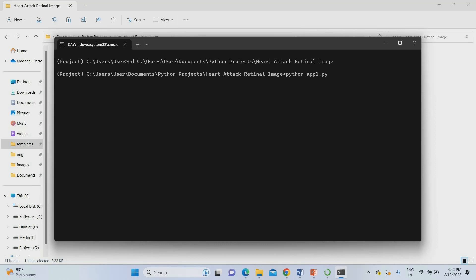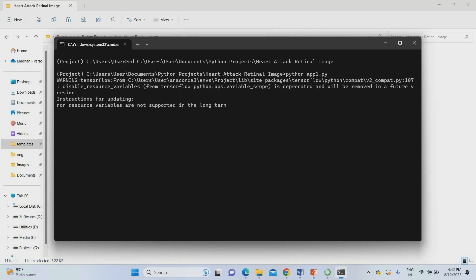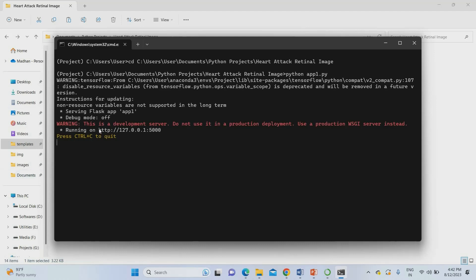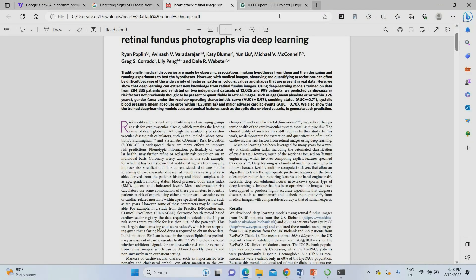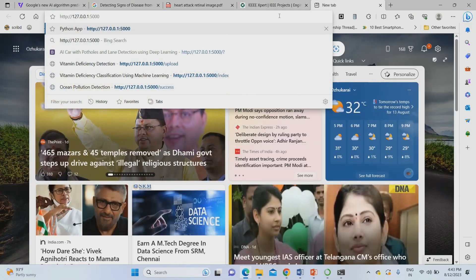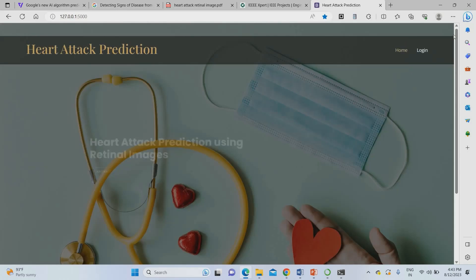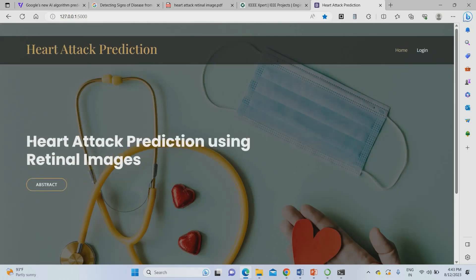I am copying the project location and pasting it in the navigator. Then I am going to use 'python app1.py' to run the code. Once I press Enter, it will create the results. This is my website address — it is built using the Flask system. I am copying and pasting the website URL. This is my project homepage: 'Heart Attack Prediction using Retinal Images.' The abstract is also given below.